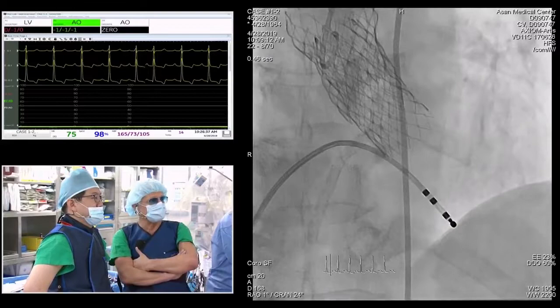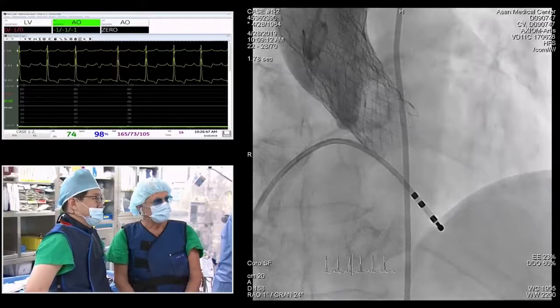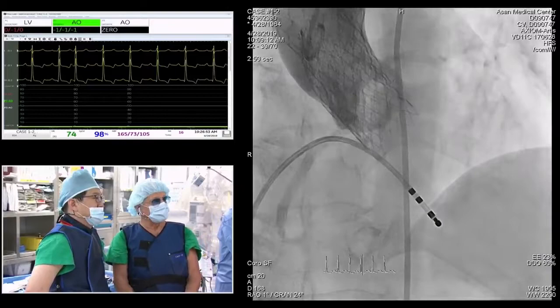And with the coronary access, I'm confident because we were through. But you need a little bit of patience to get the wire in and all that. We didn't want to do this now, with the patient being a little bit more sedated. That's why we just decided to stop.